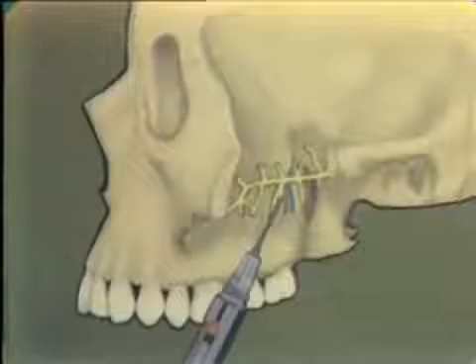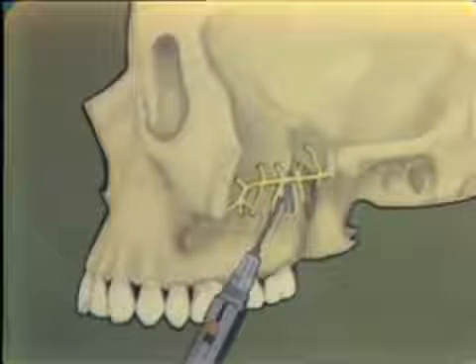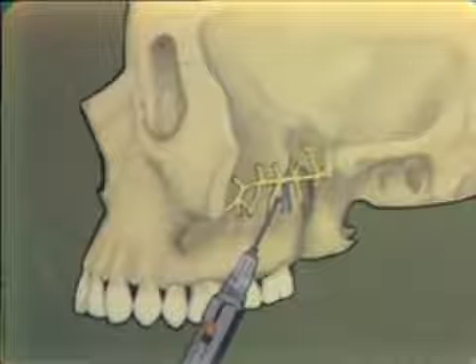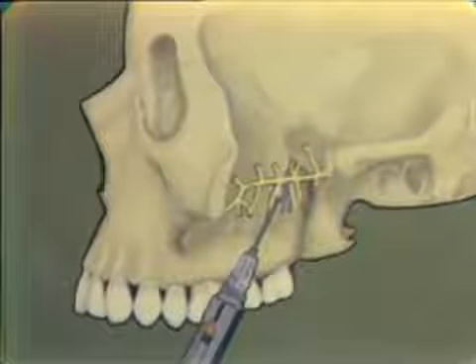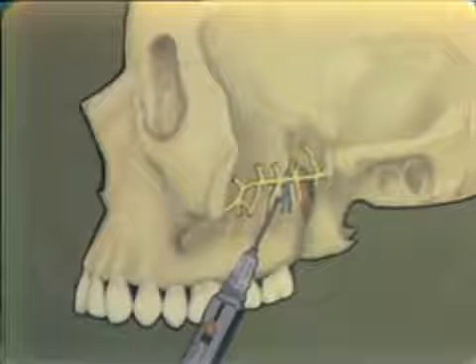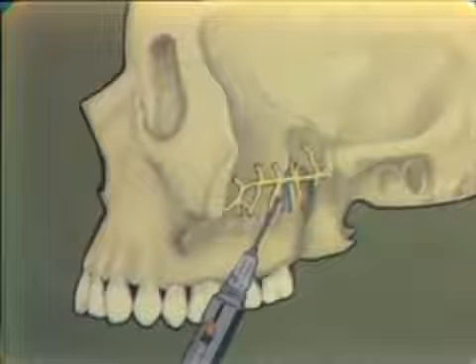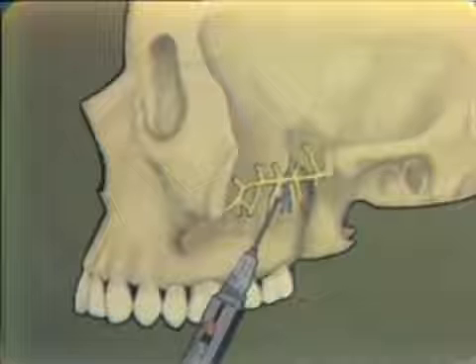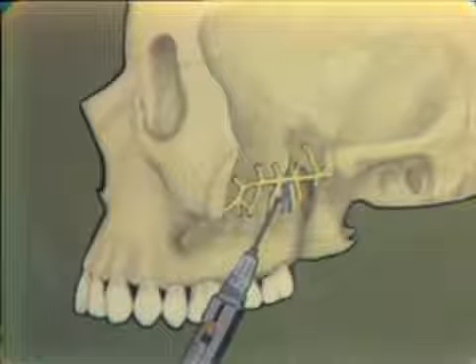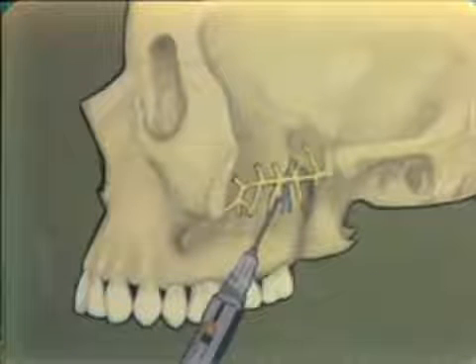A distinct advantage where that malar strut lies over either the first or the second molar, and you anticipate instrumentation on that tooth, and it just affords too much of a barrier for a buccal infiltration of that particular tooth to get through, or for the solution to diffuse through. And there are occasions when the posterior superior alveolar block is needed to afford good anesthesia of either the first and or the second molar, depending upon the site of the malar strut in relationship to the particular tooth.